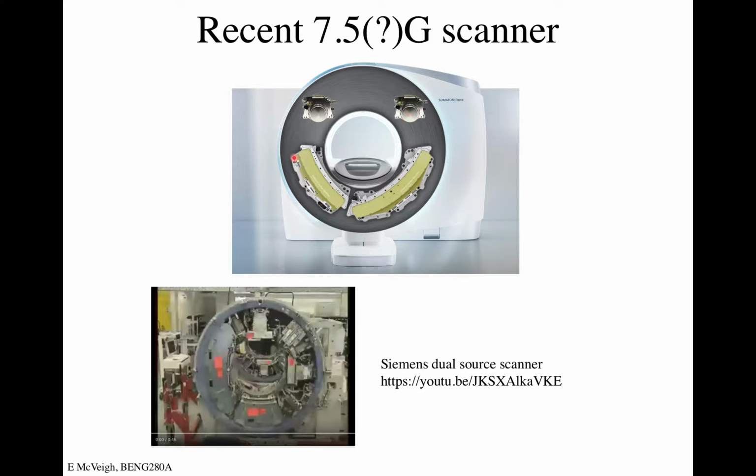So now you've got one detector here and one detector at 90 degrees, and you're basically simultaneously doing these orthogonal shots, which should just increase the number of angles you're getting for each rotation, right? So you basically can get a CT scan in half a rotation because you've got these extra detectors. So it speeds up the process of getting all of the data you need in the theta direction, in the rotation direction.